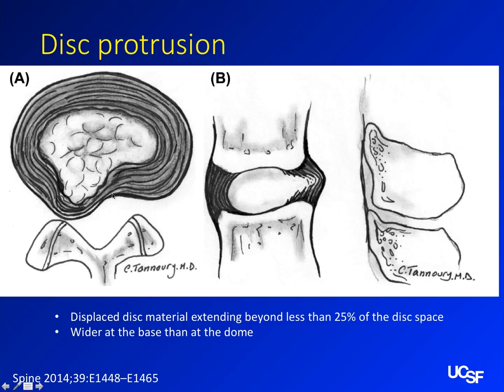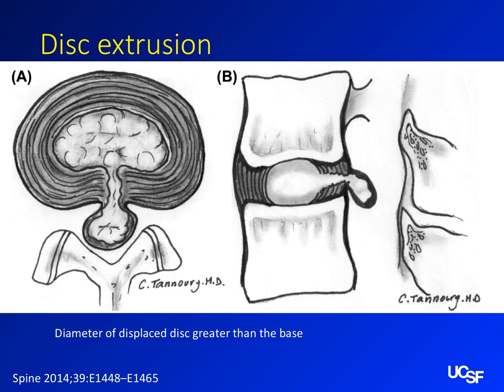So you have this disc coming out — it's clearly not the normal contour, clearly less than 25 percent, but clearly big enough to cause a problem. The annular fibers are tearing and becoming weak over time. Probably like a radiologist sitting too long on call has got a disc protrusion there. The other important thing is that it's wider at the base than it is distally — that's what defines it as a protrusion.